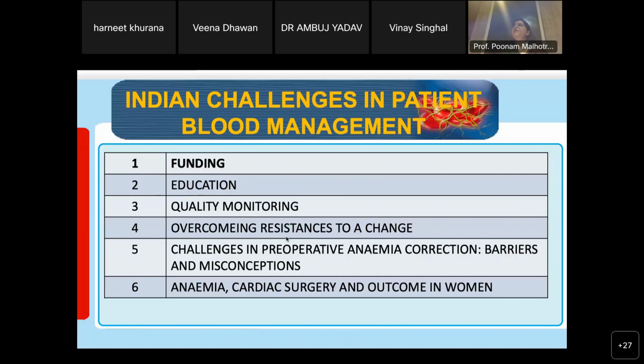So education and awareness of the existence of ECMO as a modality, as palliative care, as a supporter, as a bridge to transplant, as a bridge to recovery, as a bridge to bridge, and as a bridge to nowhere. Wherever we use ECMO, we must use it as fast as possible. While we are on ECMO, not the quantity but the quality of monitoring is important. Then overcoming resistance to change.